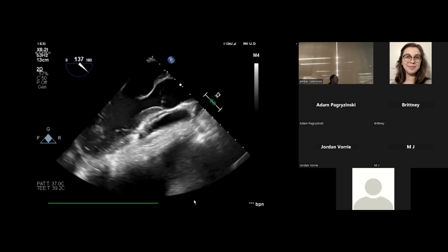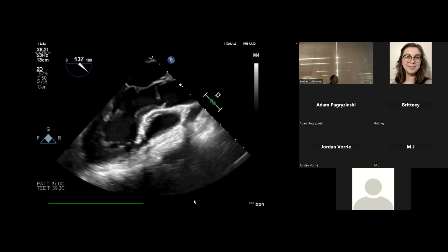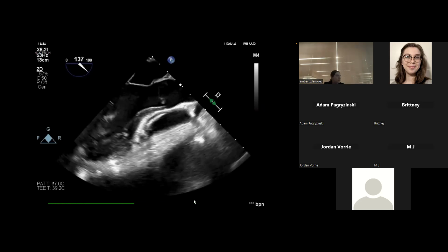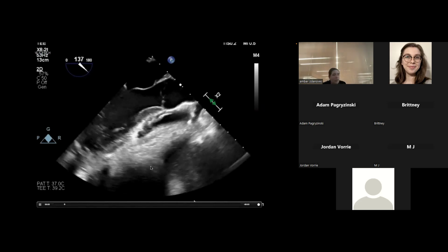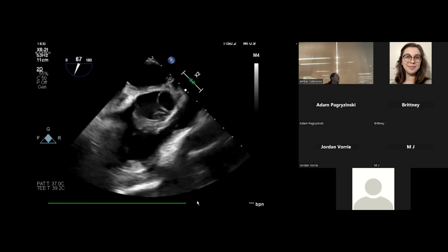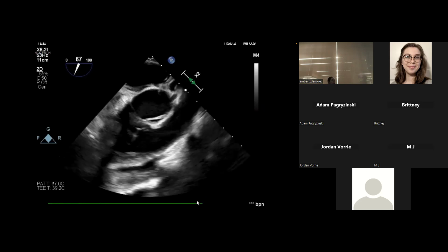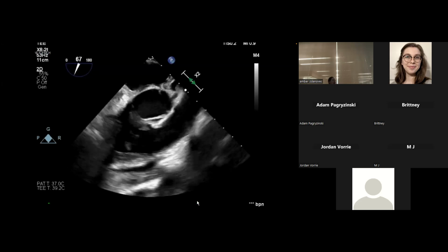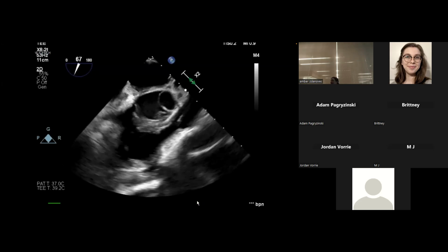And how does this movement look? Normal or abnormal? I thought it looked like the movement of the heart was coming from outside the heart, like someone was almost doing CPR. Okay, so abnormal. And then what view is this? Inflow, outflow. And how does this look? Odd. The only way I could describe it is it looked like someone was pushing on the heart externally.